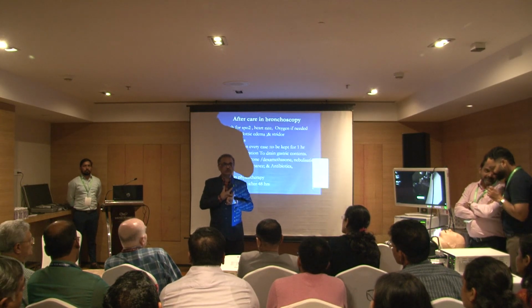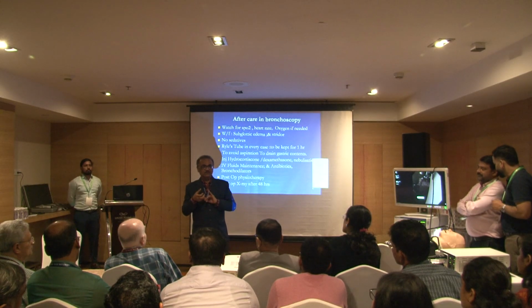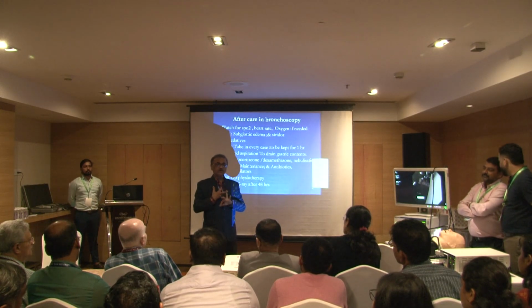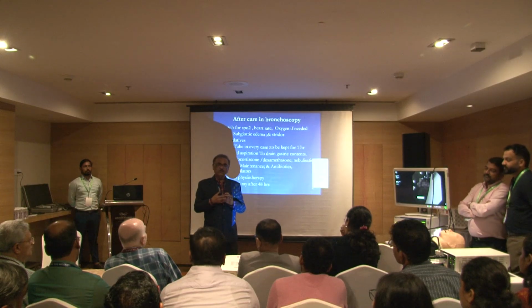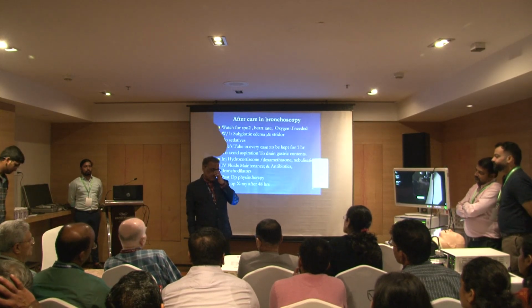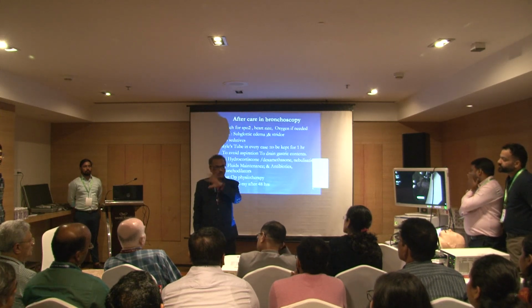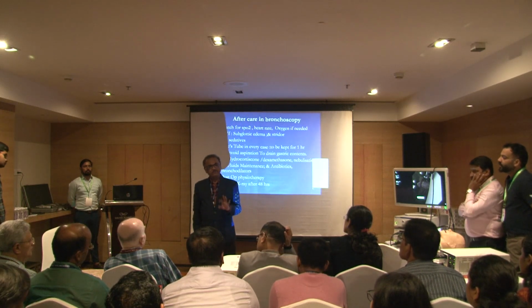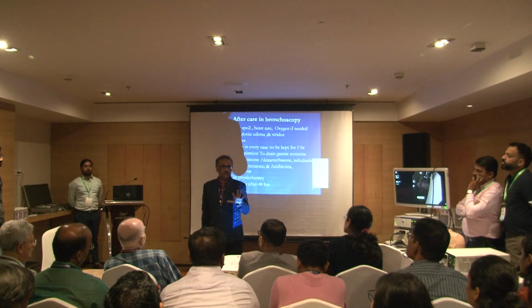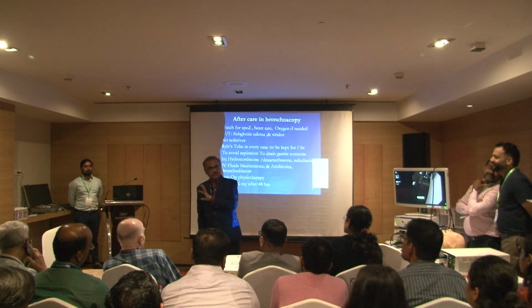The flexible scope has a role in seeing, examining, diagnosing, ruling out the foreign body, taking out the mucus if it is negative. So flexible is done when the diagnosis is in dilemma, when the pediatrician, parent and myself are all in confusion. Put the flexible scope, see the bronchial tree.